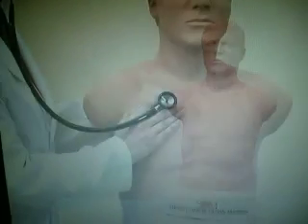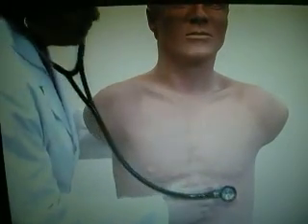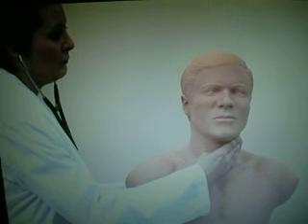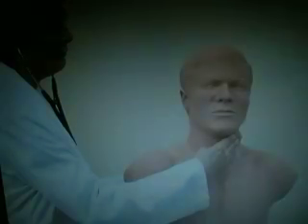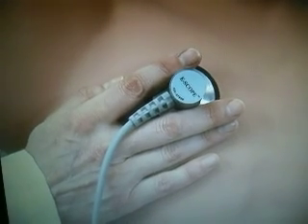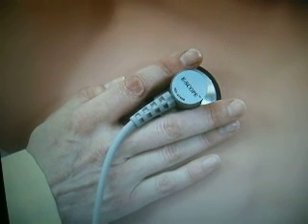Heart sounds are heard at the aortic, pulmonic, tricuspid, and mitral areas. A carotid pulse in the neck is supplied to provide a positive indication of the first heart sound and the onset of systole. Now let's listen to a few sounds. We'll start with the severe aortic stenosis, as it illustrates several interesting features.